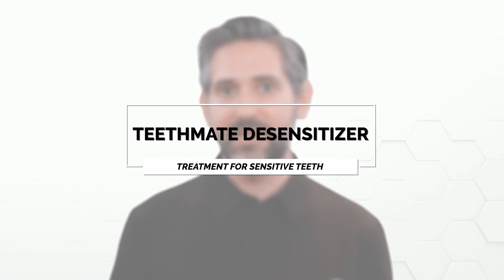Hey guys, Dr. Matt Najad here, and I want to talk to you about one of my favorite products for desensitizing teeth. It's from Kuraray and it's called Teethmate Desensitizer.